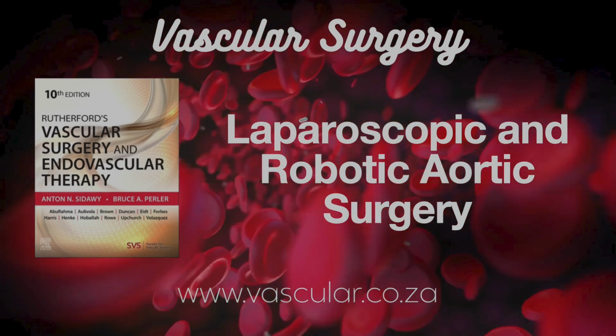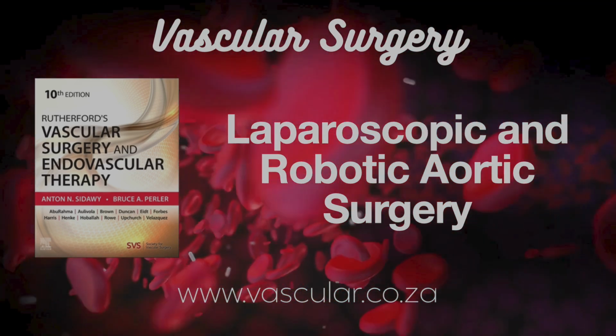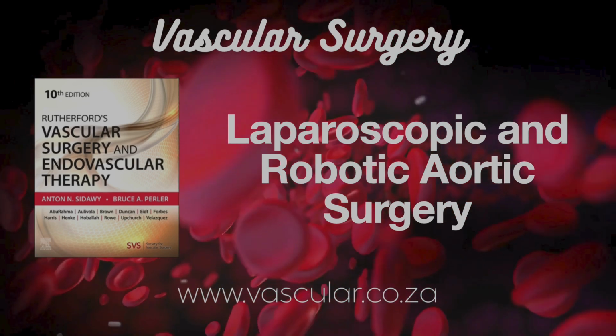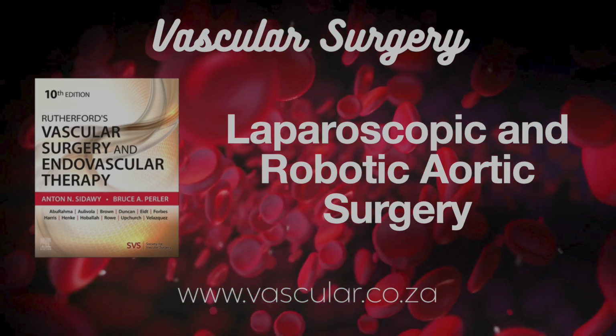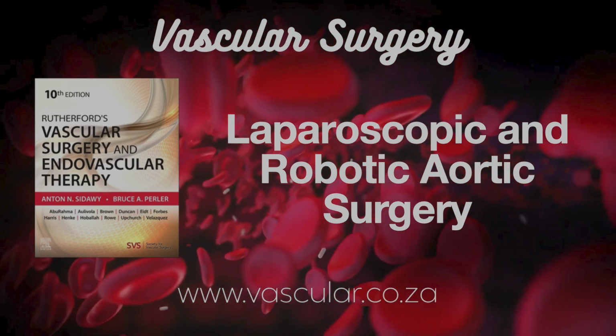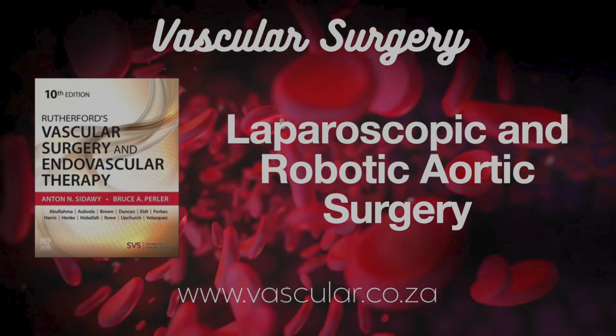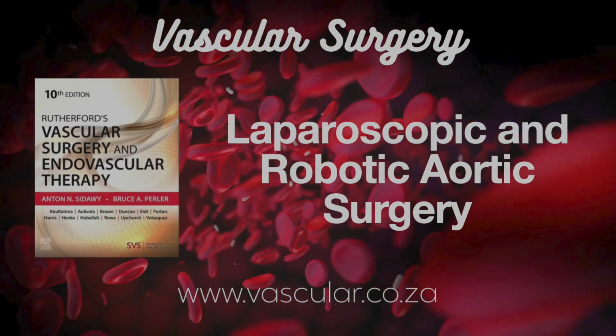For AAAs, they can use robotic tools to clip off those little lumbar arteries feeding the sac. Right, to stop back bleeding. Exactly. And they might use a special fenestrated grasper, one with holes, to handle the aneurysm sac gently. For sewing, they often use Gore-Tex suture, and there's a specific running stitch technique using a pledget to anchor it.